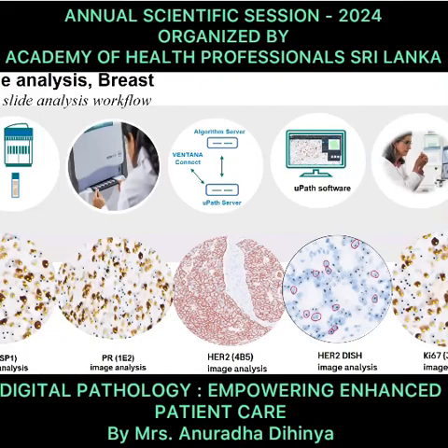Now, there is image analysis, which I was talking about: ER, HER2 detection, Ki-67. In the market, there are FDA approved assays, and Roche also has those algorithms. We also have CE-IVD approved algorithms. When you're planning to buy a scanner and an algorithm piece, you should consider buying at least CE-IVD approved algorithms.